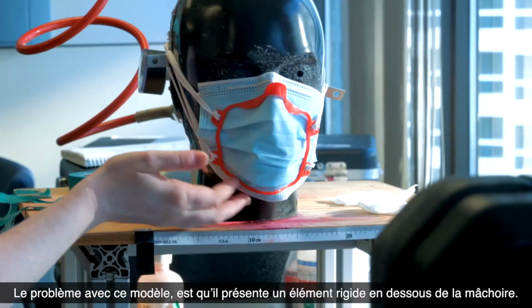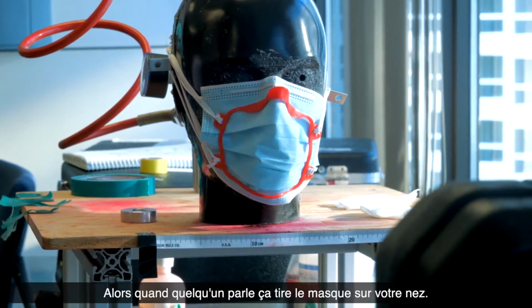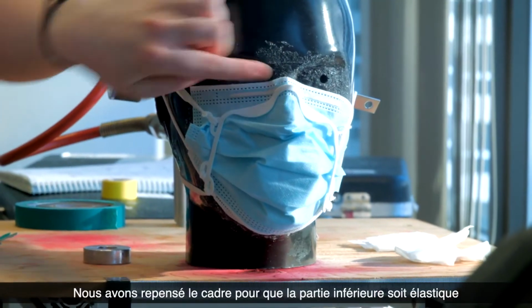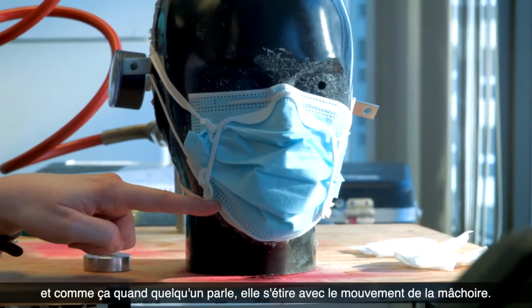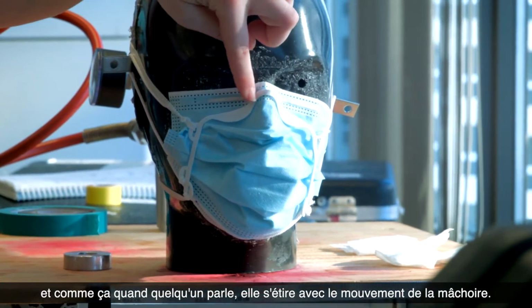The problem with this model is it has a rigid jawline here. So when anybody's talking, it pulls the mask into your nose. We redesigned the frame so that the bottom part is just elastic. And that way when somebody talks, it stretches with the movement of the jaw, so that it doesn't cut into the nose at the top.